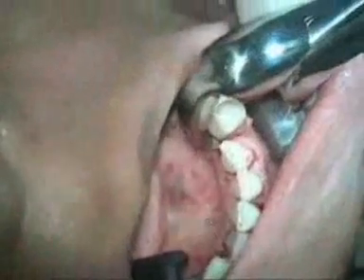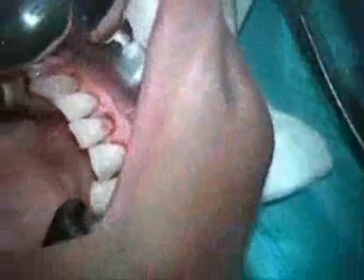We move on to the canine. The beak is placed in the lingual sulcus and the tooth is easily rotated out. I then repurchase the tooth, placing the bumper on the crown in order to remove the teeth more occlusally to avoid any damage to the buccal plate.